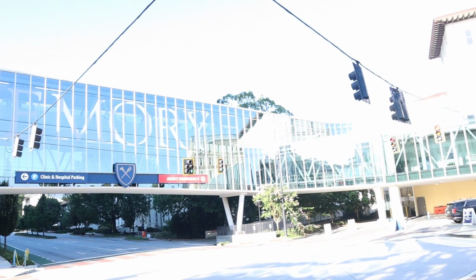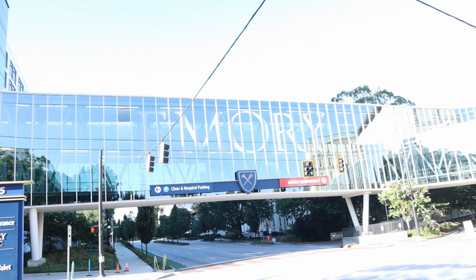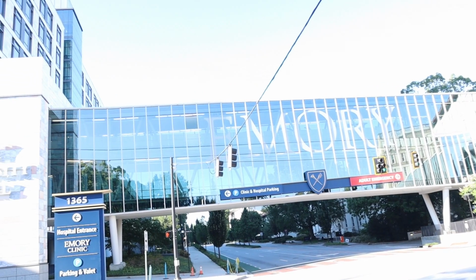Today we're here at Emory University to take a look at the day in the life of an interventional radiologist with Dr. Park and his team, who's going to be placing a gastric tube. Interventional radiology is answering a lot of questions and providing options to patients who have few others. So come with me and let's take a dive into the day in the life of an interventional radiologist with Dr. Park and his team.